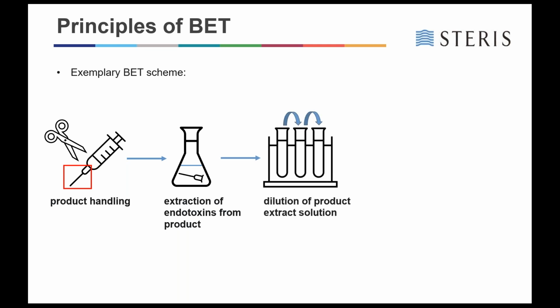So then once the extraction is completed, we'll do the analysis portion. And during the analysis, a dilution of the product extraction solution is typically done not to exceed our maximum valid dilution. And then the final step would be the actual assay.